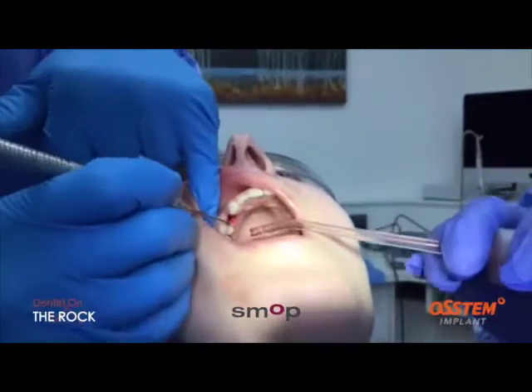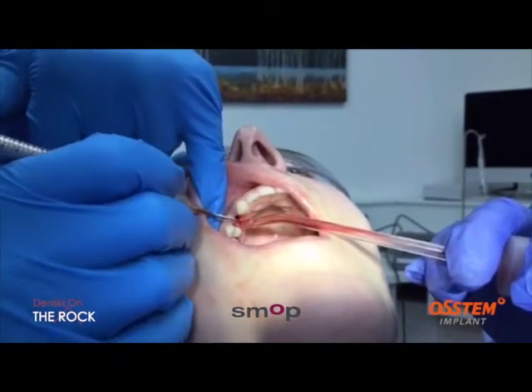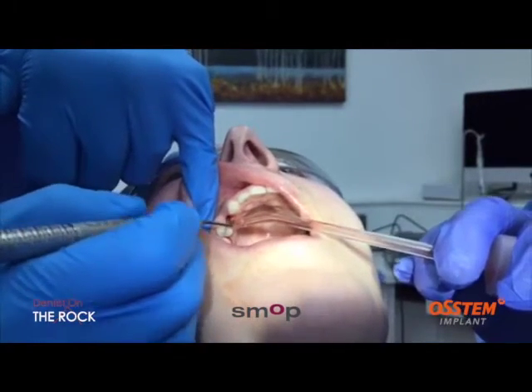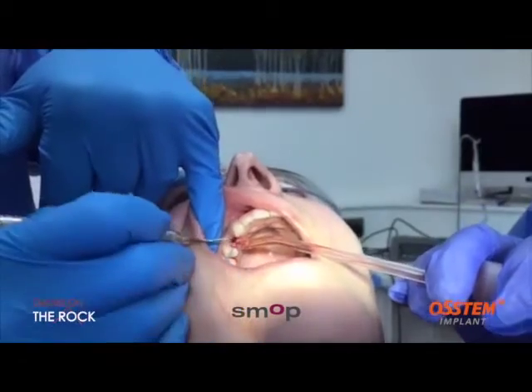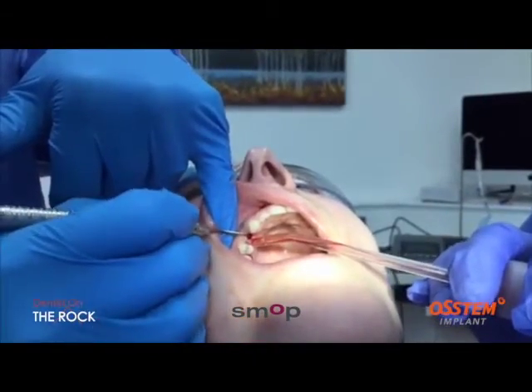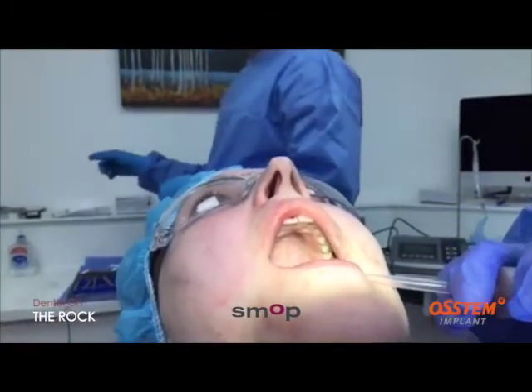Now, believe it or not, that's all the drilling done there. Is that okay? So again, I'm feeling the fully prepared osteotomy. Everything's lovely. We've still got a good shoulder bone here, all around. Perfect. Ready?